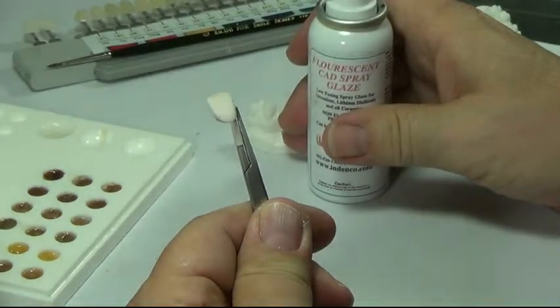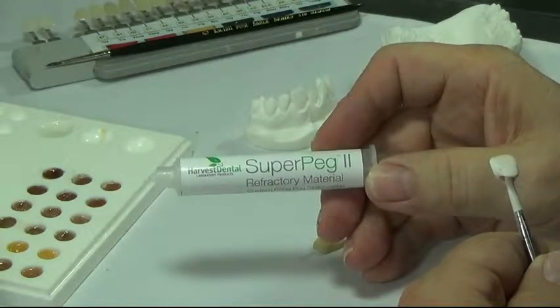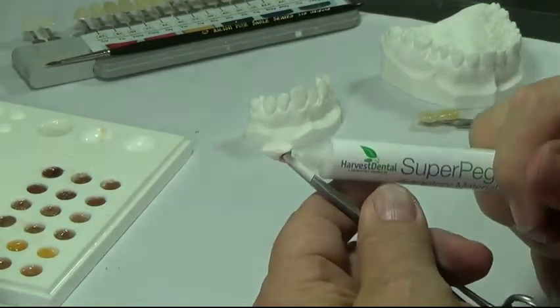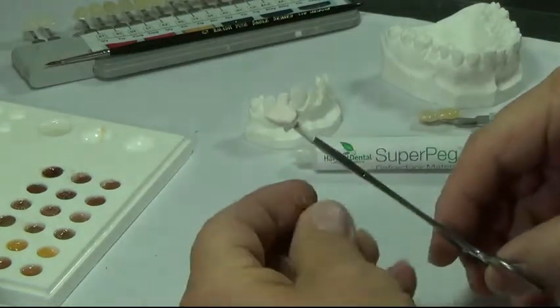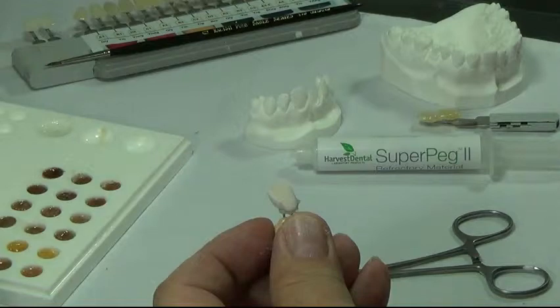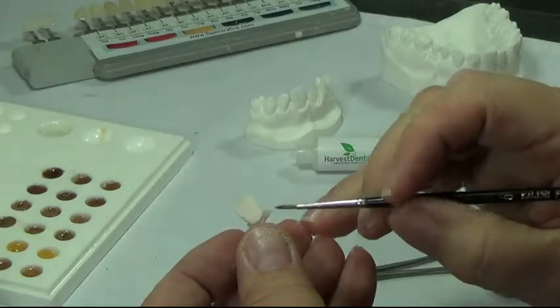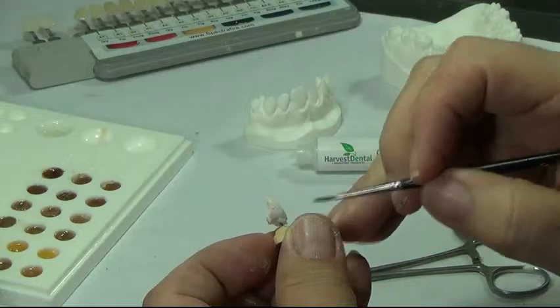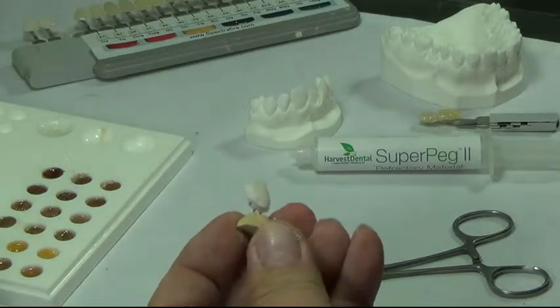Now we're ready to put it on the peg. We're going to fill the crown using Super Peg 2 from Indenko. You may want to take your brush and inspect the edge — anything that may be underneath, you want to wipe it. And now we're ready to fire this crown.